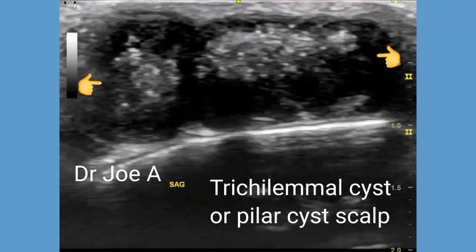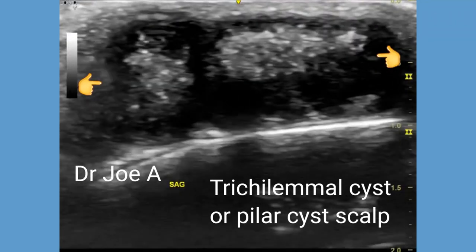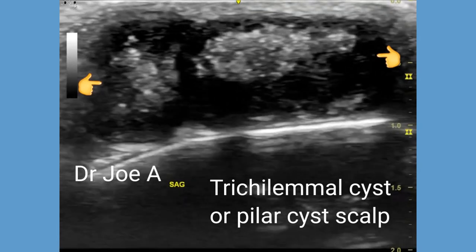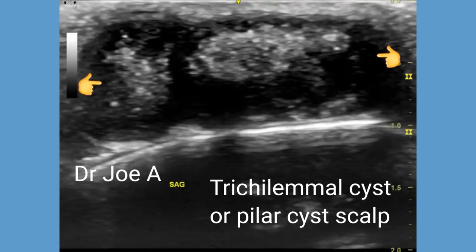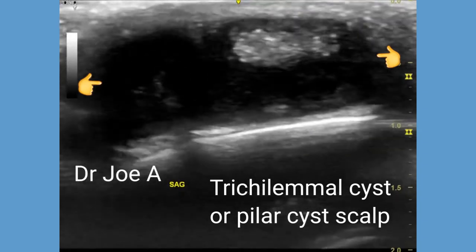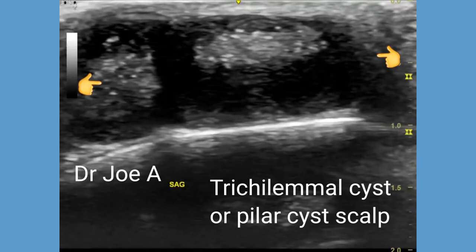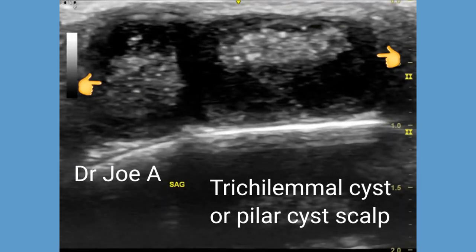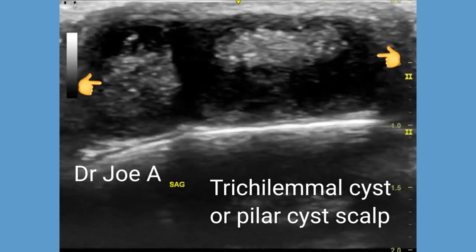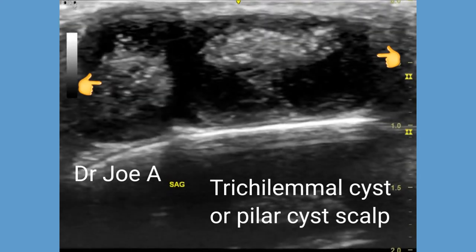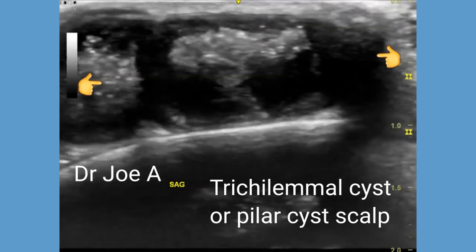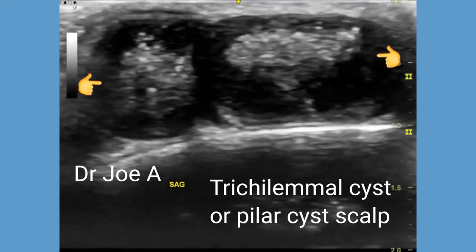A trichilemmal cyst, or pilar cyst of the scalp, is a keratin-filled cyst that originates from the outer sheath of the hair follicles of the scalp. This is seen most commonly in the scalp in middle-aged women. The cyst also commonly contains a central echogenic area formed by cholesterol crystals or calcifications.